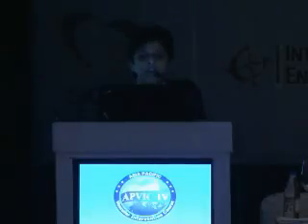Now, machine presets. Basically, all ultrasound systems have presets which are made available to us by the company. First and foremost, you have to press the probe you want to select. In our system, we have a Philips IE33. So L9 probe is the button I will press, and I will choose what area I want to scan, whether it is the carotid, arterial, or venous. Presets are programmed to optimize images based on certain gain, power settings, focal zones, frame rate, and other settings. So you must choose the correct preset before scanning.